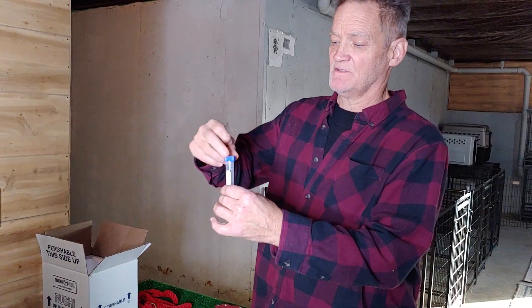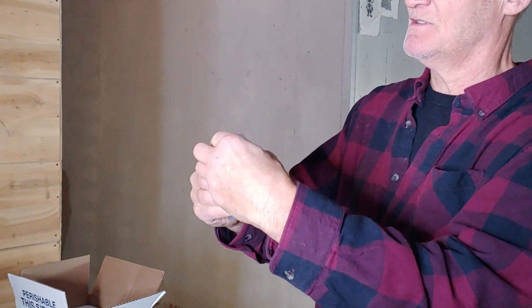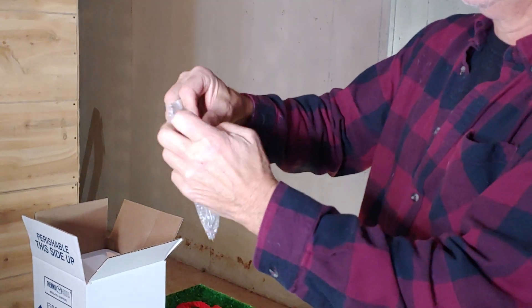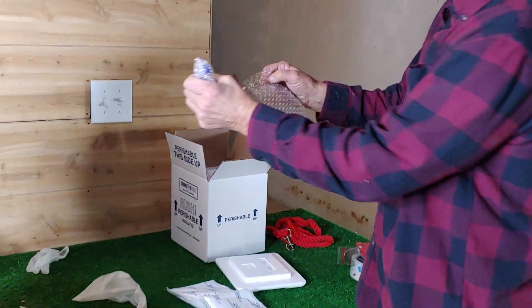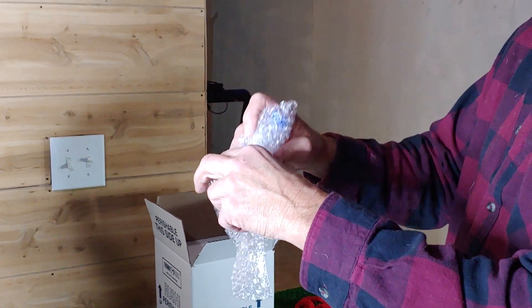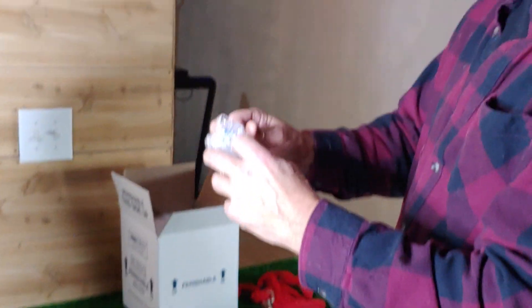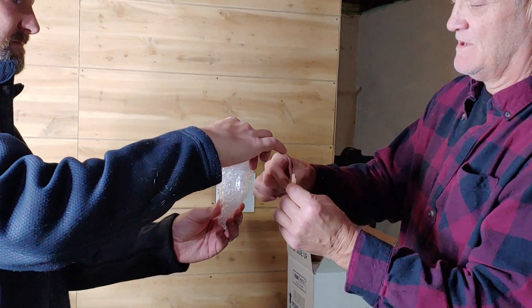Make sure the cap is tight and put tape over the top so that just in case during shipping nothing comes loose. Then take these little bubble wrap bags and put it in one, close that up, and take a second bubble wrap bag around it. It's really important because you don't want it to get too cold too fast. We've done a ton of shipments and this is what truly works. I'll put a piece of tape around there to secure it.